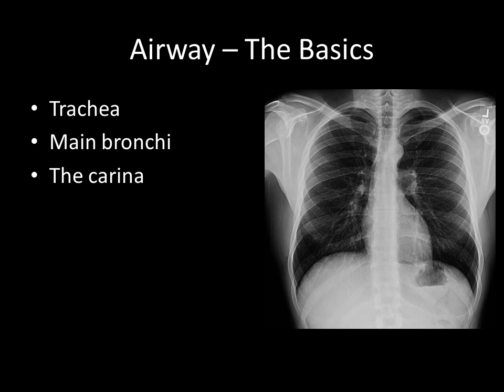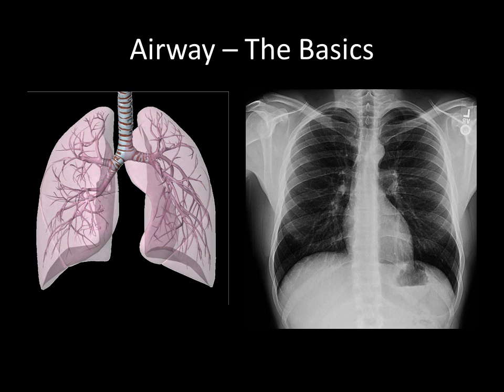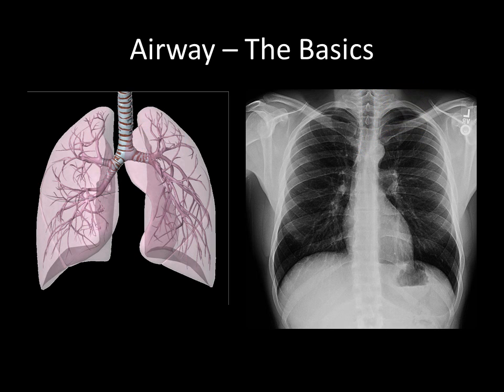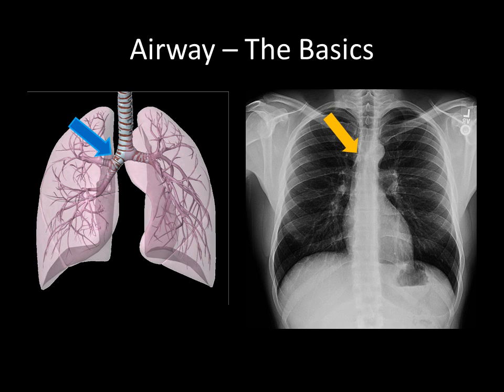We'll cover some of the basic airway anatomy: the trachea, the main bronchi, and the carina. On the left is a computerized diagram of these structures; on the right is a normal chest film. The trachea runs from superior to inferior, and on the chest film we see it as a hypodense column or cylindrical lucency in the midline. The left main bronchus appears as a curved hypodense column curving into the left lung field. The right main stem bronchus also appears as a curving hypodense column, though in this example it's not quite as visible. The carina is approximately located here on the chest film — a cartilaginous structure running from anterior to posterior that divides the trachea into the left and right main stem bronchi.